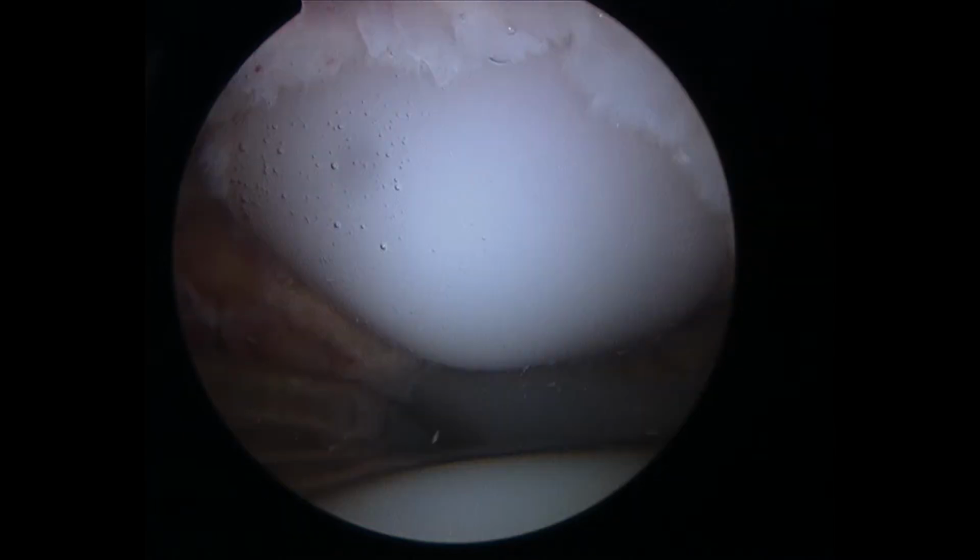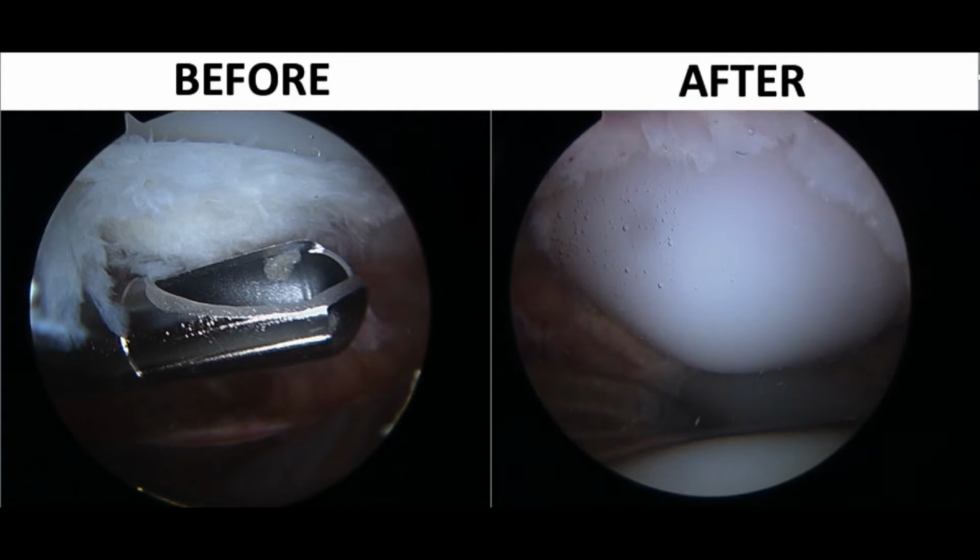And you can see now that's the button of the patella. That's the part that got resurfaced. And you see the mirror image below because that's articulating against the metal. So that was really where the problem was coming from. So we cleaned up all the tissue in and around her patella. And I've done this in the past, and it's very successful for people to have relief of their symptoms.